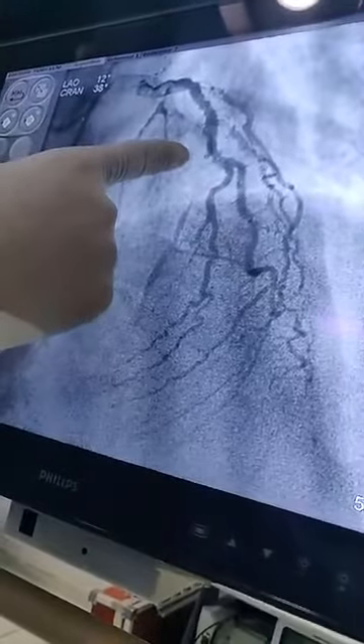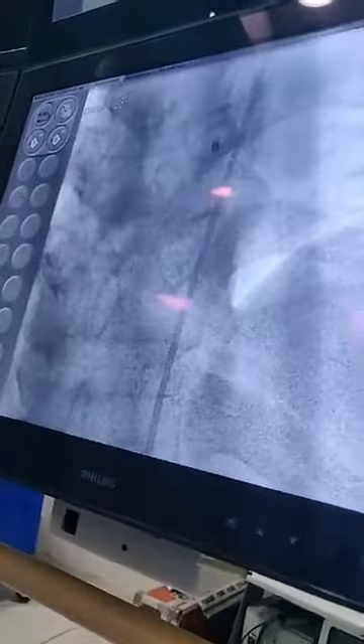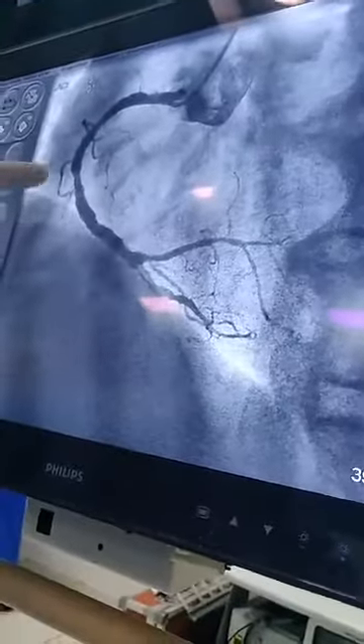If you can see, the artery is blocked 100% — this is the left anterior descending artery, filling up slowly into the distal part of the vessel. The right coronary artery has got minor blockage, which is about 50% in the mid segment.